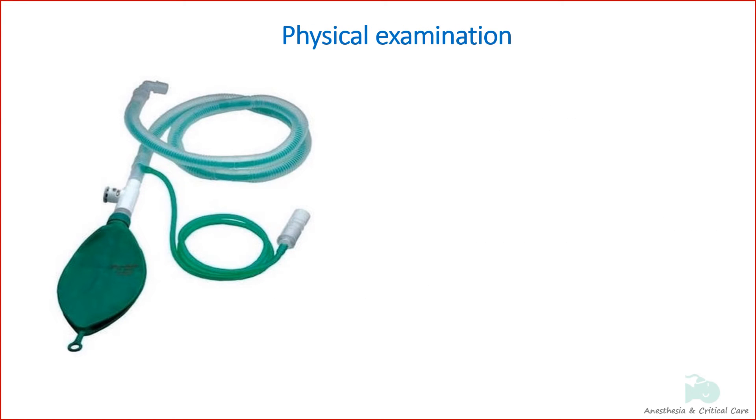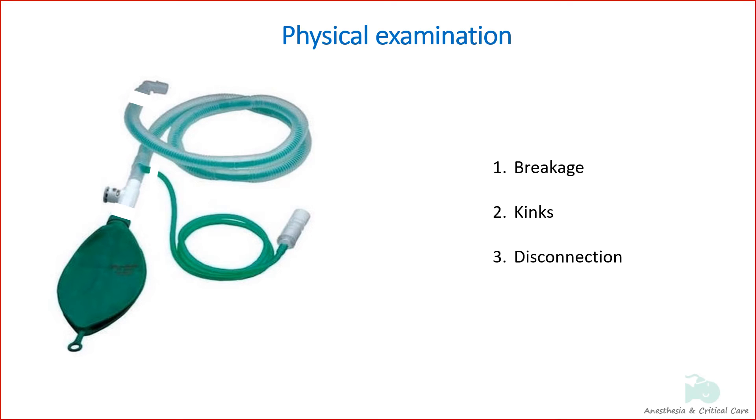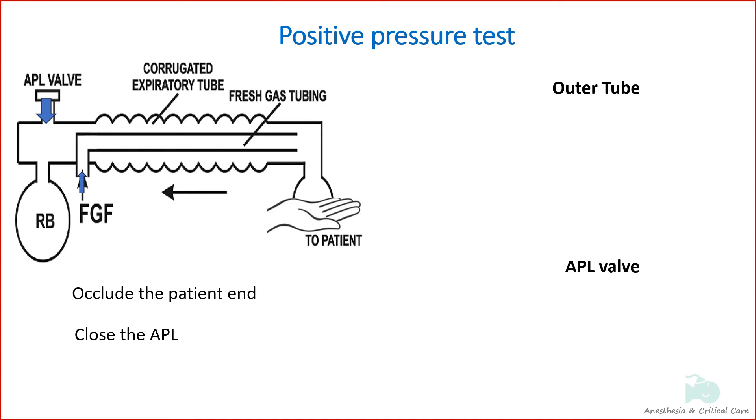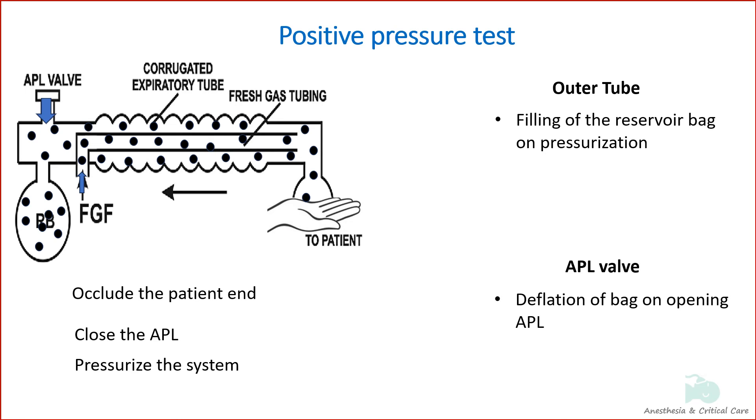The physical test involves checking for breakage, kinks, and disconnection of the parts of the system. The positive pressure test checks the integrity of the APL valve and outer tube. It is done by occluding the patient end, closing the APL valve, and pressurizing the system, which fills the reservoir bag — confirming the outer tube is not leaking. The APL valve is then opened; the bag should deflate easily if the valve is working properly. Outer tube integrity can also be checked by wetting the hands with spirit and blowing air through the tube — a leak will produce a chill sensation in the hands.